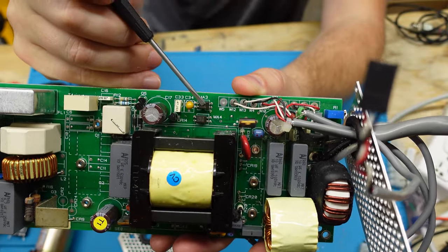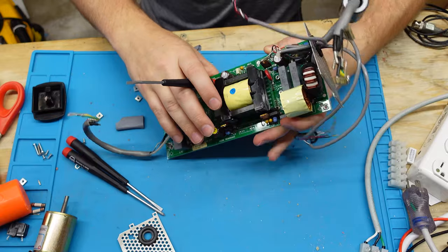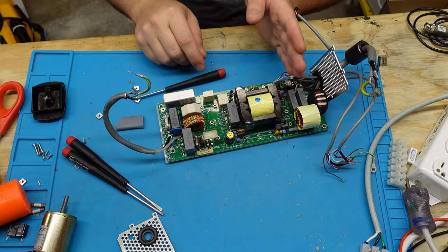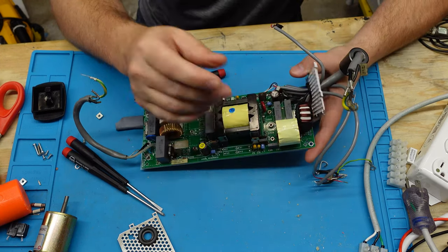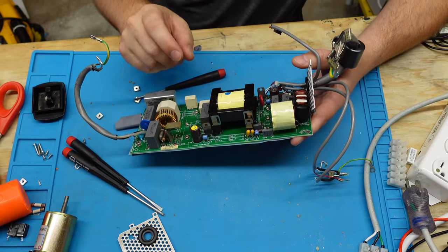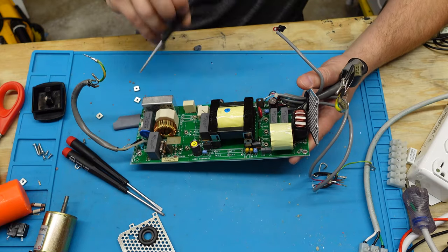Let's see, right there's one of them. There's a second one right there. So those are opto-isolators. And what they do is they give a power feedback to this side of the board, telling it, hey, I need more power or I need less power. And that basically connects the two sides without using a wire, because, you know, we want to isolate the two sides of the board.